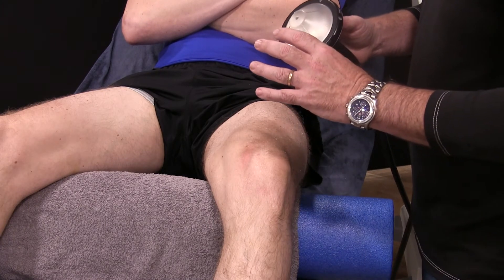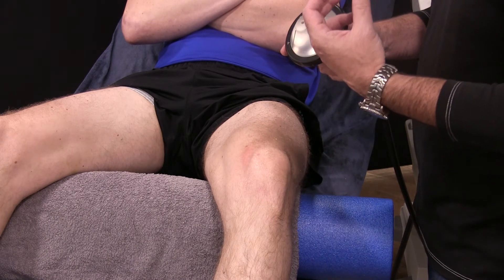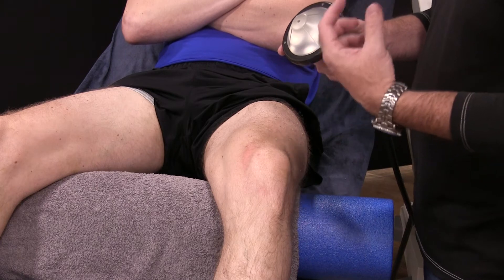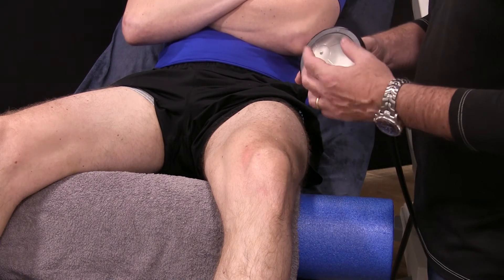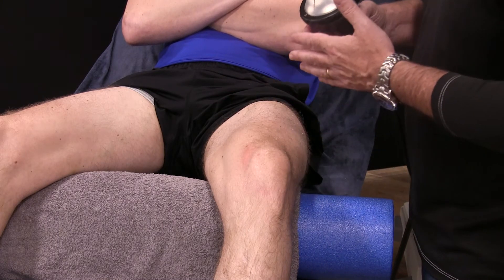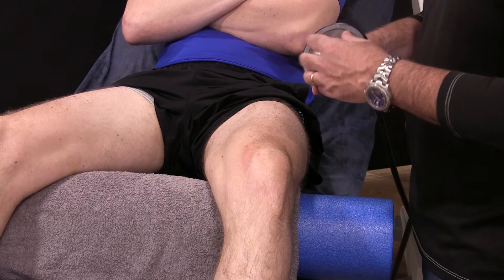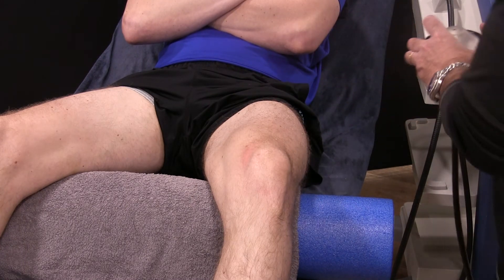The key thing is that radial shock wave is where we're using either an electromagnetic or some sort of compressed air, firing a projectile indiscriminately at tissue and hoping that that shock dissipates and hits its intended target. Whereas here, we're really going at it with a very specific focus.